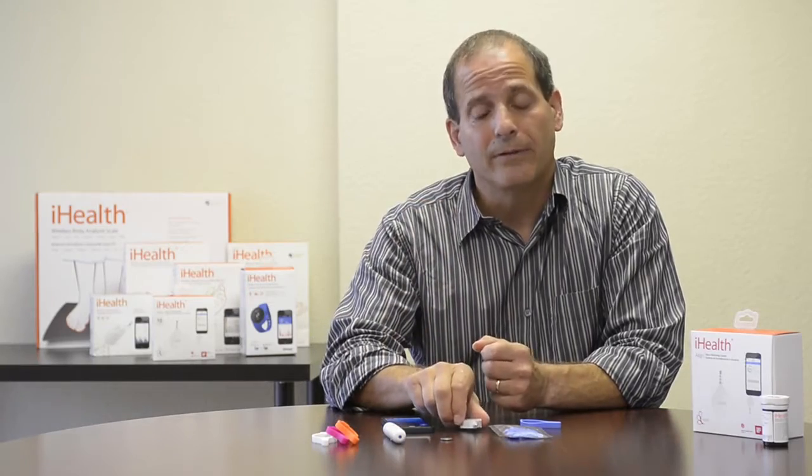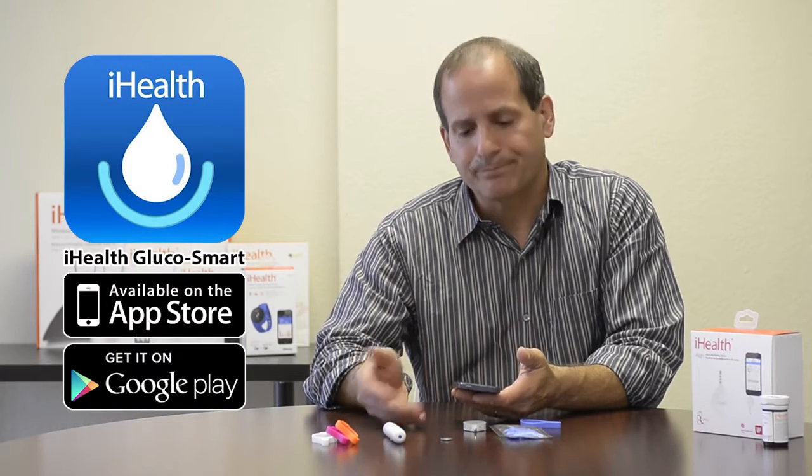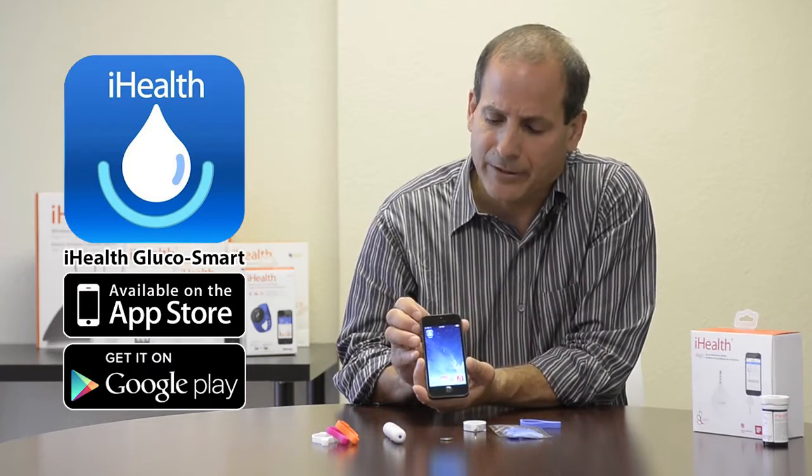Once the battery is installed, the next thing you want to do is download the app. Our product comes with a free app that you can get at the App Store or Google Play. It's called Glucosmart, and you can see I already have it loaded on my phone.